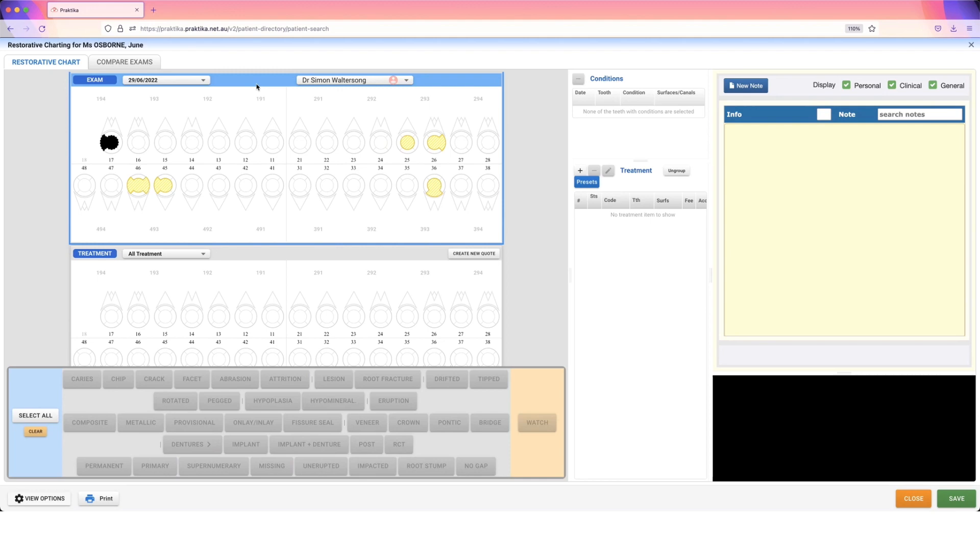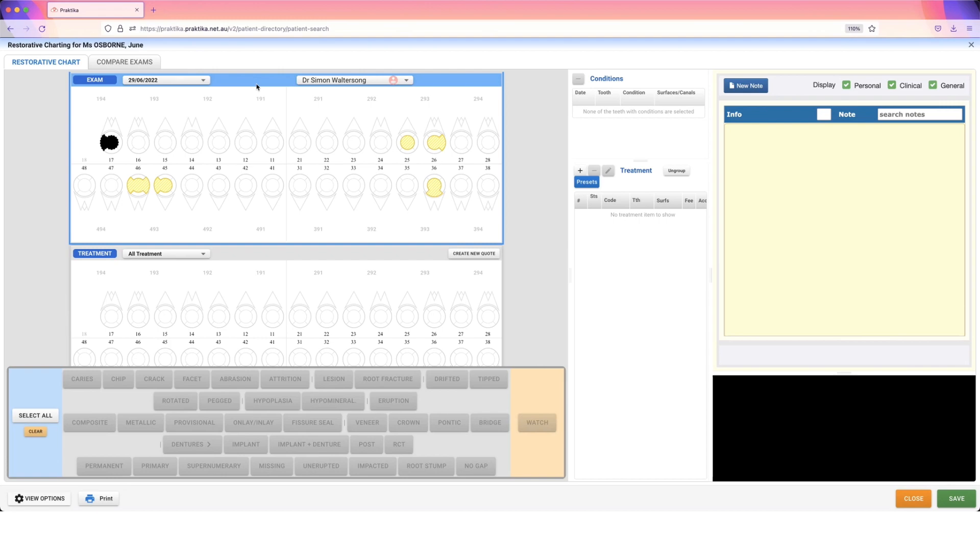There are a number of different keyboard shortcuts available. You can find these all within the help section of Practica. So on your main screen of Practica when you step out of the patient file, on the left-hand side you will see a help bar. They're all listed in there.